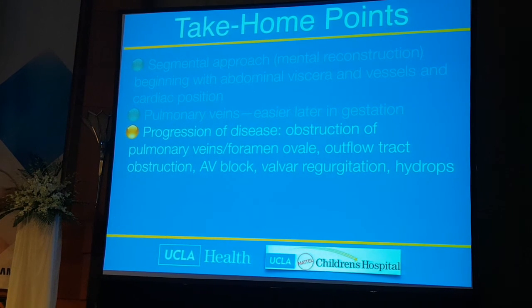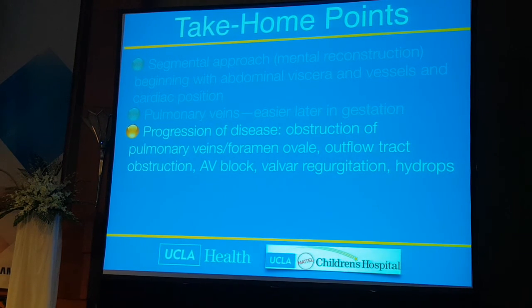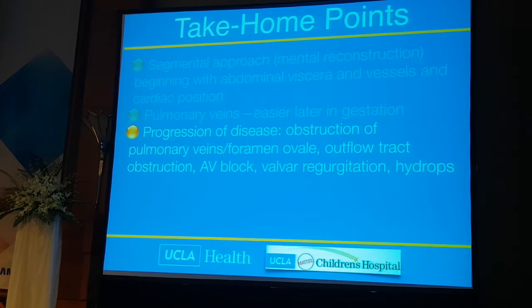Pulmonary veins are very important to evaluate with heterotaxy because these problems are quite common and because they can have an important impact on prognosis in terms of how you counsel and in terms of where you deliver and how you deliver. Conceivably it may require C-section. But they may be difficult to detect. Even TAPVR may be difficult, even when we do all the kinds of things that we're talking about today in terms of optimizing the image.